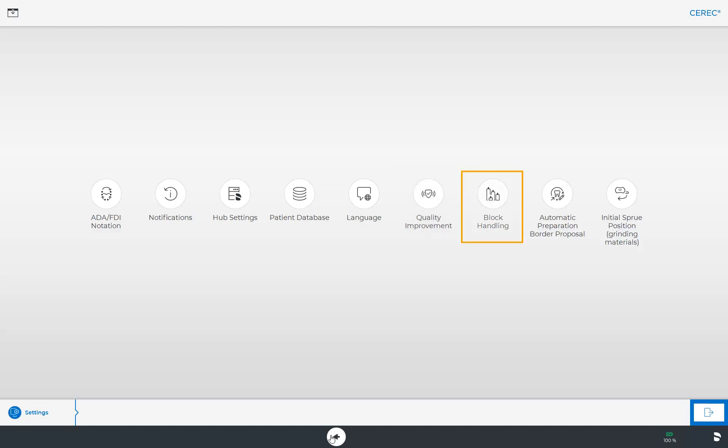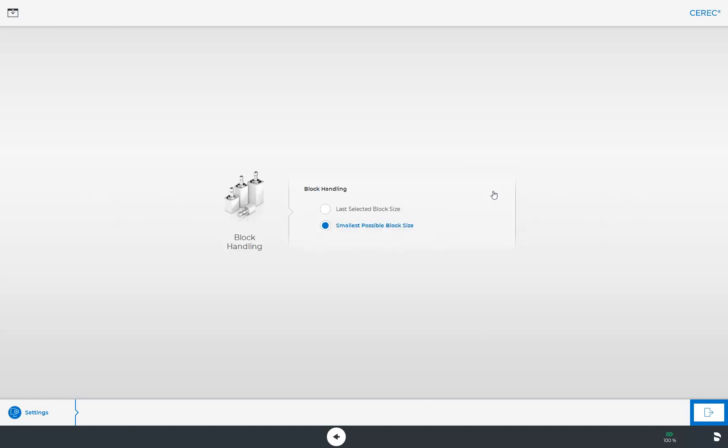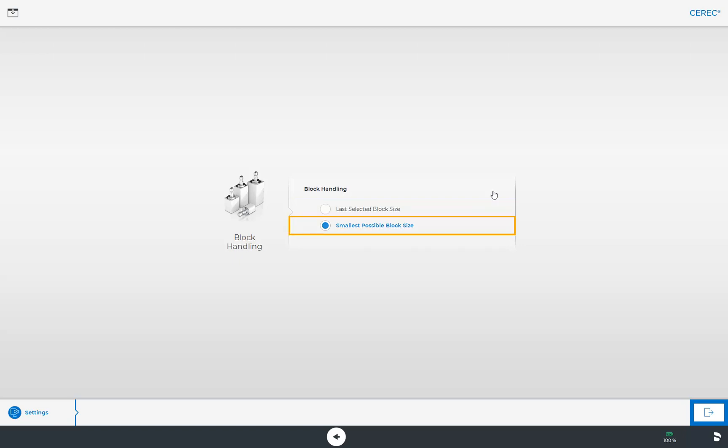We will look at the submenu Block Handling in more detail. Here we can determine whether we want the last selected block size to be automatically displayed, or the smallest possible block size of the respective material manufacturer. To turn on the last selected block size option is helpful in case you work only with one material producer and you are focusing on single tooth restorations.